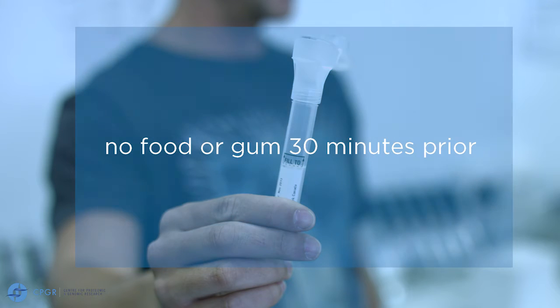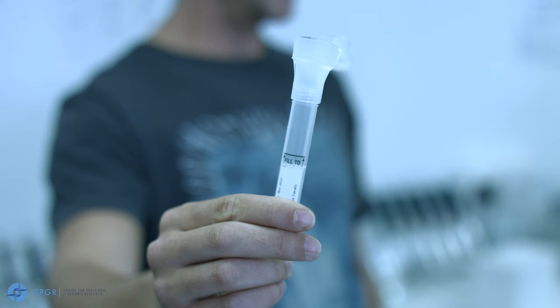When collecting saliva samples, the patient must not have eaten or chewed gum for 30 minutes prior to the collection.